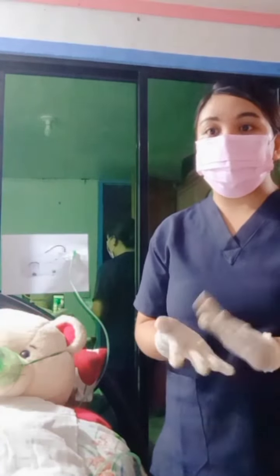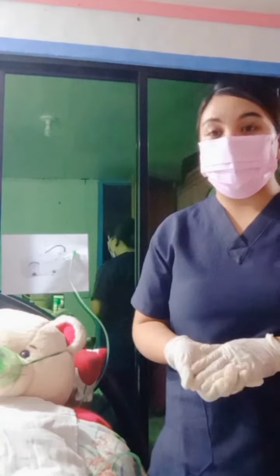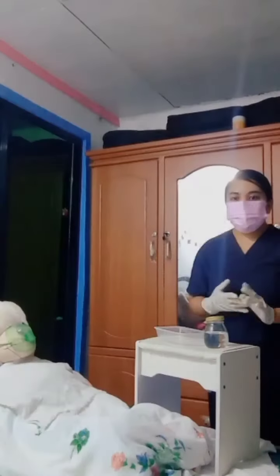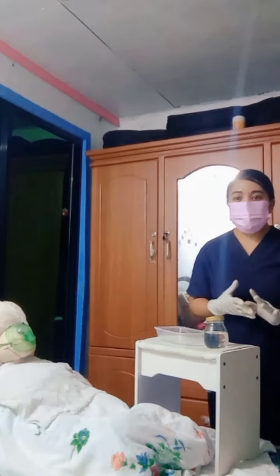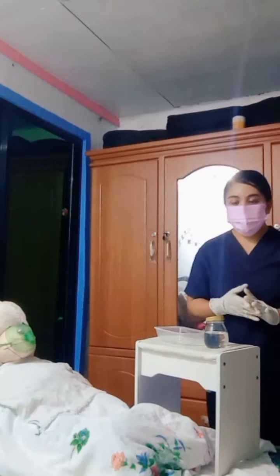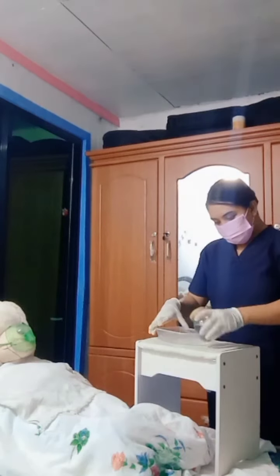So after checking the pressure by plugging the end of the tubing, place the open-ended tube near the patient within easy reach of your work area. Now prepare the suction catheter by opening the suction kit or catheter using aseptic technique. Fill the tray compartment with about 100 ml of sterile saline solution or sterile water.